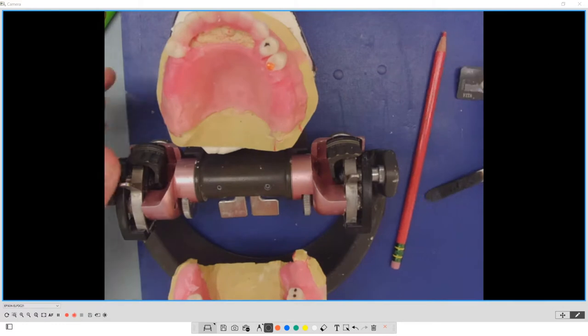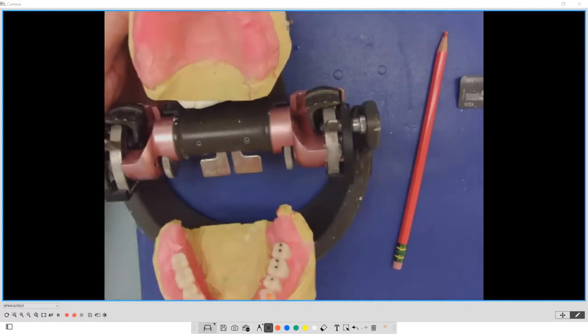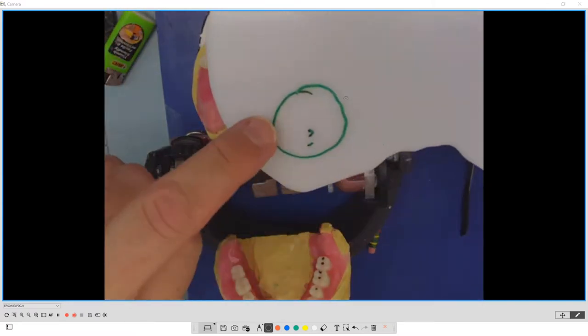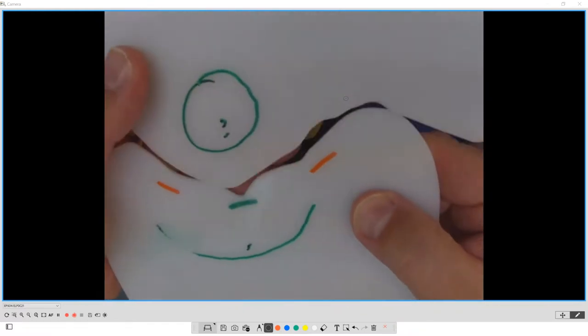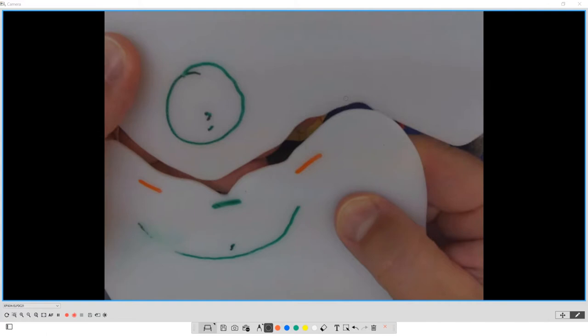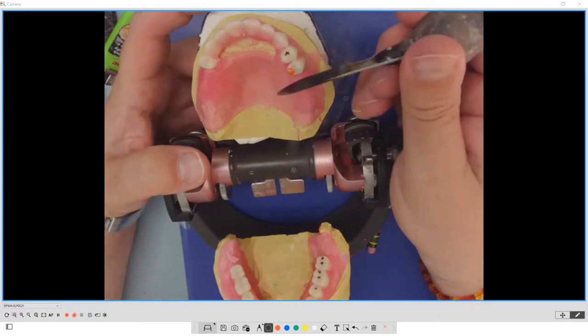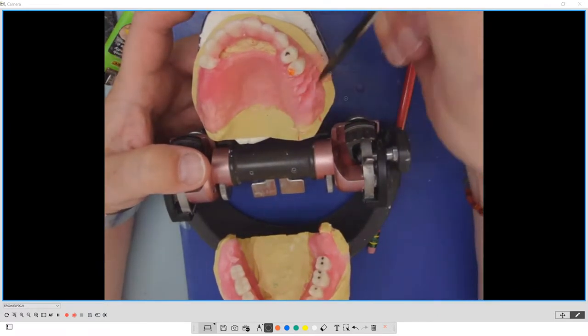So remember, we have the oversized lingual cusp for lingualform teeth. Remember, this is oversized. So even though I can set this in a working and balancing, this cusp is bigger on these teeth for that reason. Why? Because it's a crushing tooth, mortar and pestle type of design that works within the chew cycle of a patient.